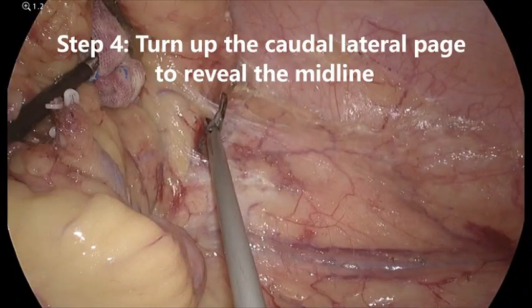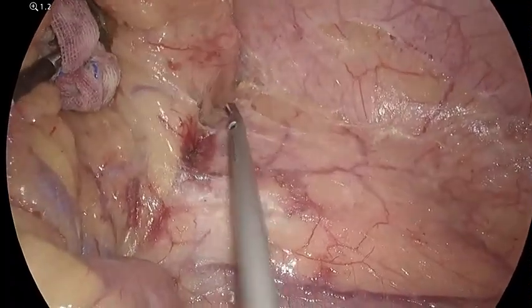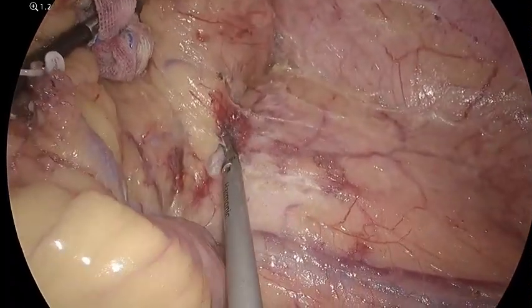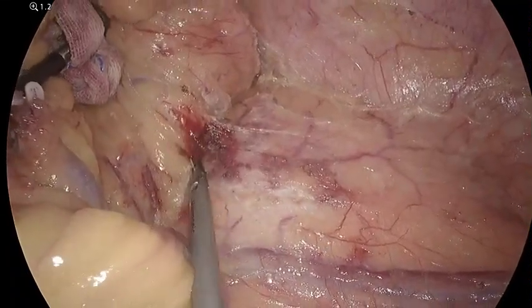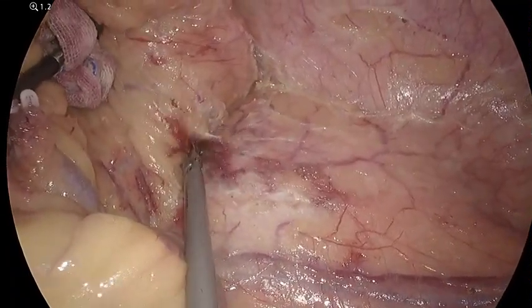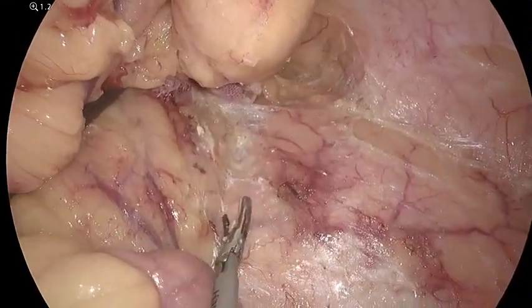Step 4. Expose the midline. Elevation from the caudal and lateral aspects towards the cephalic and medial directions, freeing and exposing the midline. This surgical approach mitigates inadvertent entry into the posterior aspect of the pancreas.